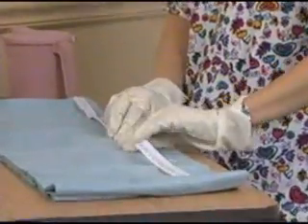If you meet resistance or suspect a catheter fracture at any time during the removal procedure, notify the patient's doctor immediately.